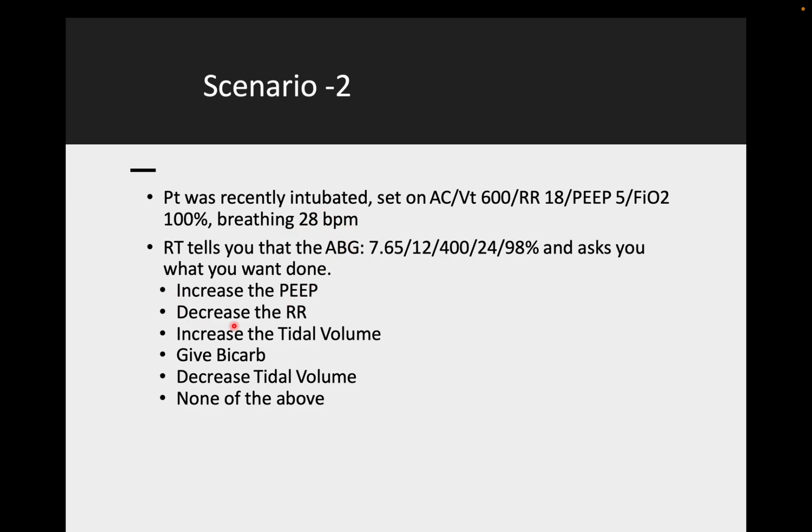So if you decrease the respiratory rate more, what will happen is the patient is breathing more, spontaneous breaths are more, and you are not supporting that ventilation. So there is no point. The patient is already breathing more. There is no point in decreasing the respiratory rate per se. So what is better in this patient? Because he is hyperventilating, he is going into alkalosis because of the CO2 washout. Because spontaneous breaths are there, there is no point in decreasing the respiratory rate.